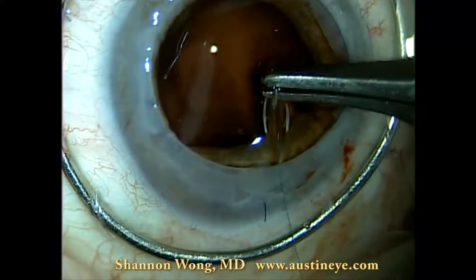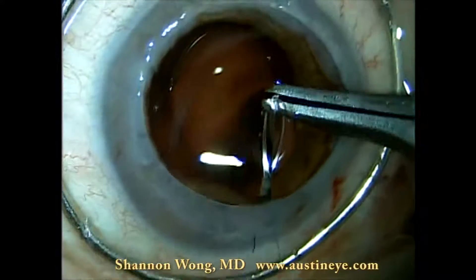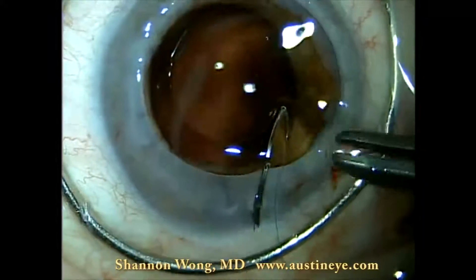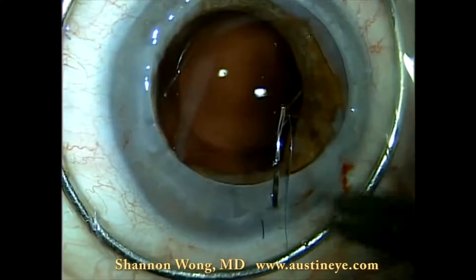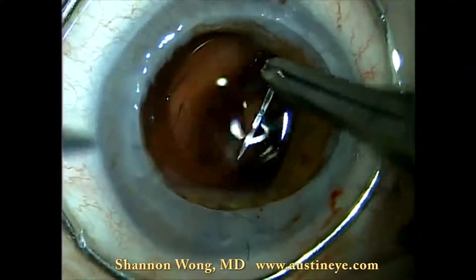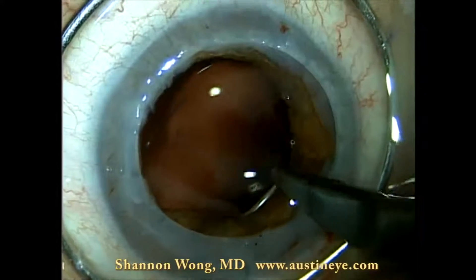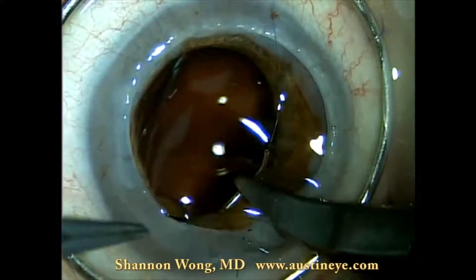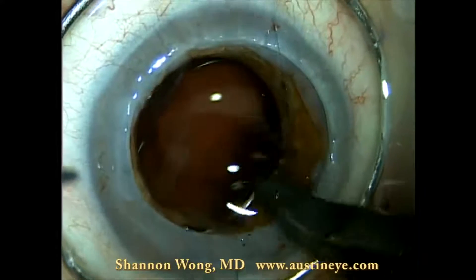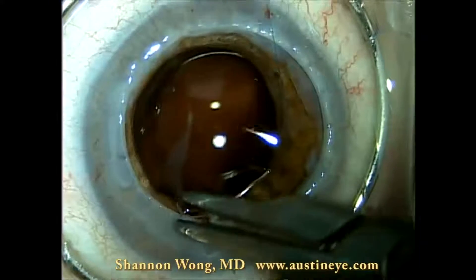As I was using the suture to do a pupilloplasty, I knew I was going to stabilize this lens implant by suturing it to the iris before the case was over. I didn't want to risk the chance that this lens may become malpositioned weeks or months after surgery, requiring a fourth trip to the operating room to correct her condition.